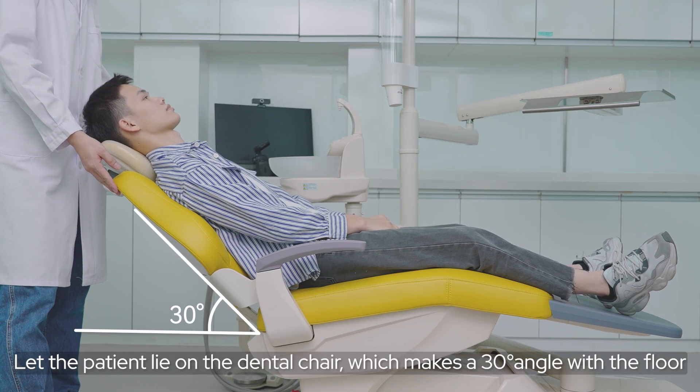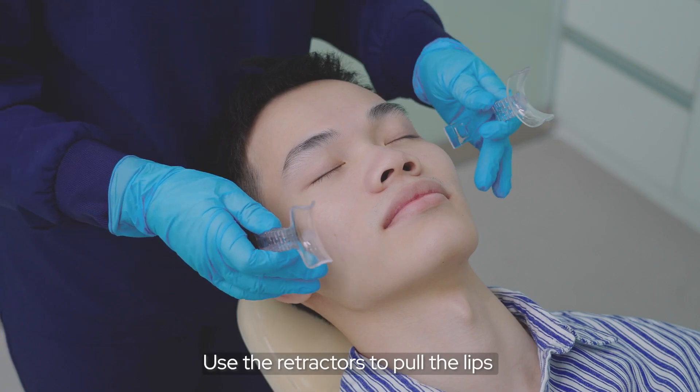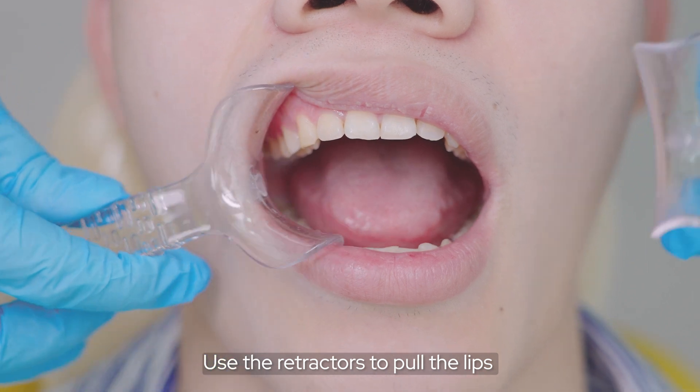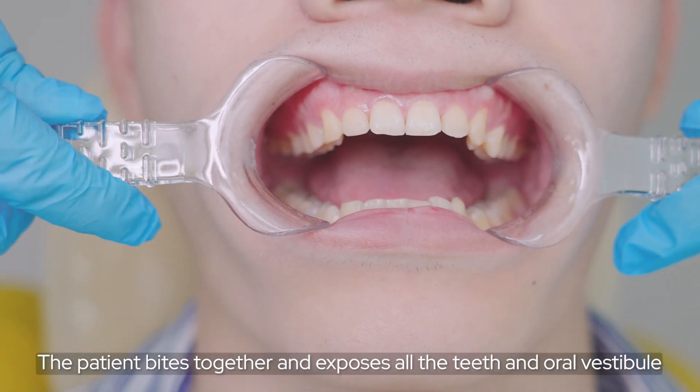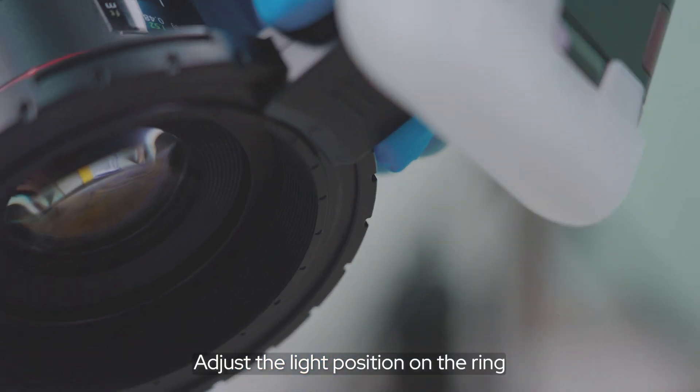Let the patient lie on the dental chair at a 30-degree angle with the floor. Use the retractor to pull the lips. The patient bites together to expose all the teeth and oral vestibule. Adjust the light position on the ring.